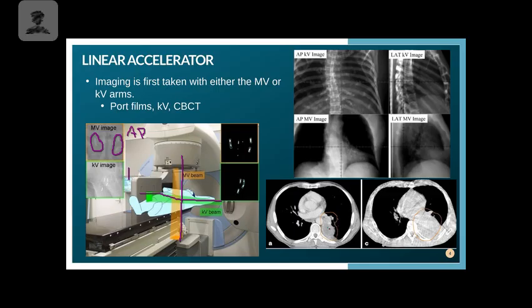And then this is our lat, and I can tell because I can see part of the pelvis and where the hips line up. So here still is where we're seeing those fiducial markers. And so we're able to align from the very first day until now. Over here, you can see the fiducial markers, the green surrounding them, is where we had them placed before. So we're trying to make sure when we flip back and forth that they are aligned correctly.